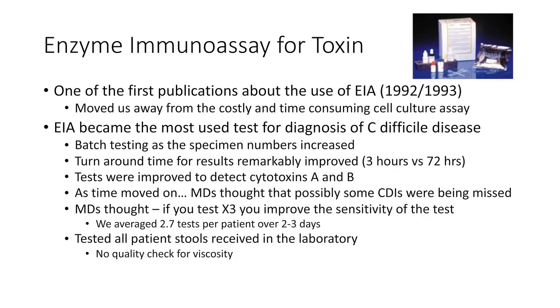During this time period, we averaged 2.7 tests per patient that were usually sent to us over 2 to 3 days. Of course, at that time, we were testing all the patient stools received in the laboratory. There was no thought about whether it was really that soft or liquid or how hard the stool might be. Of course, the physician knew what was correct, and any stool that was sent to us, we would test.